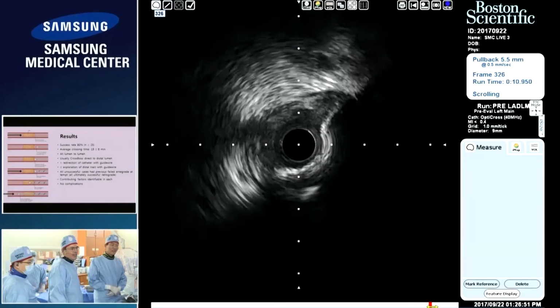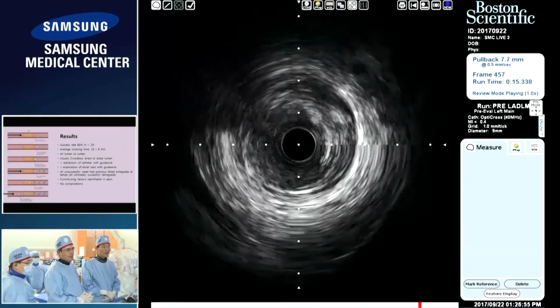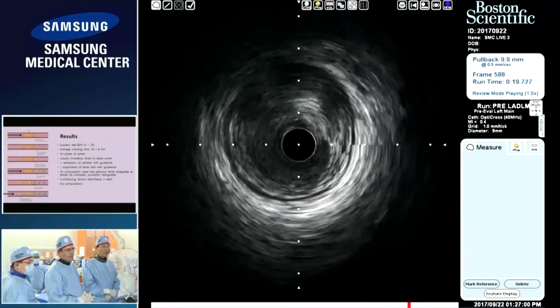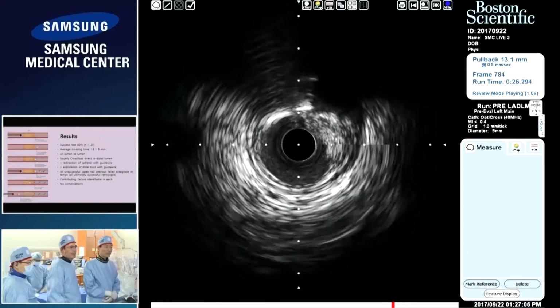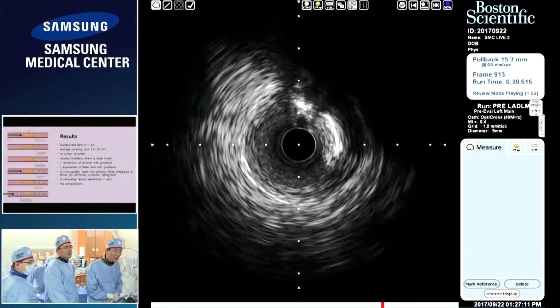Distally, as I'm more focused on the vessel size, the lumen size is 2.5, 2.75. The vessel size is more than 3.5, here we almost are 4. So we can do a good EEL measurement here. So stent, no, not yet.